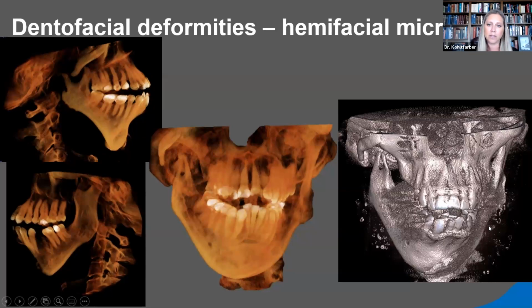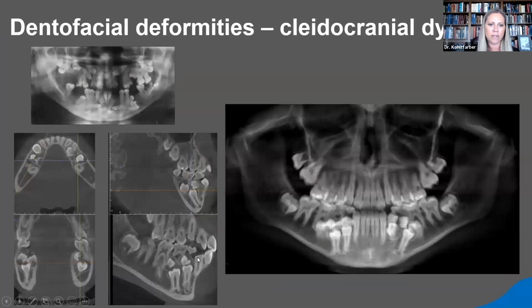That would be definitely a reason to go ahead and take our CBCT. We also have osteoma cutis with this. So this poor patient won the genetic lottery. We actually have agenesis of the condyle or condylar head on that particular side, on the right side. So these are more advanced cases, and definitely a CBCT is going to be extremely helpful to you.